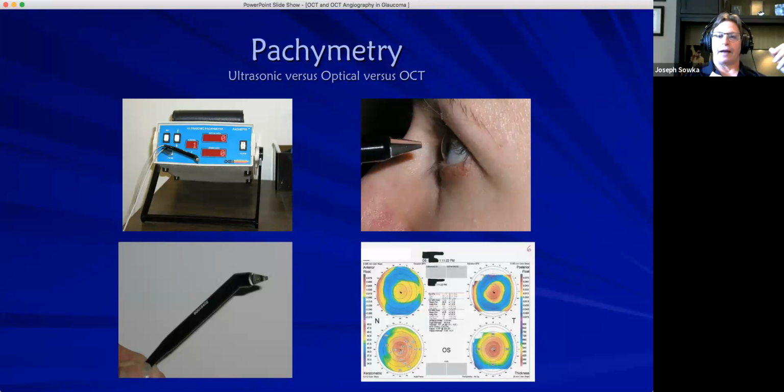Yeah, that was something that my wife did. I helped with that, and what we found was OCT pachymetry was almost always uniformly a little bit thinner, and it was freakishly reproducible, whereas ultrasound pachymetry had a greater standard deviation where it wasn't quite as reproducible. And so, as you said, that's because it's hard with your hand in free space to become perfectly orthogonal to that cornea, where it's much easier with the OCT.